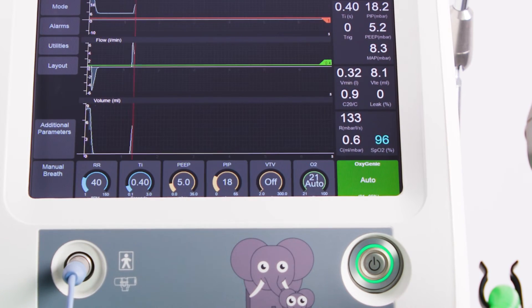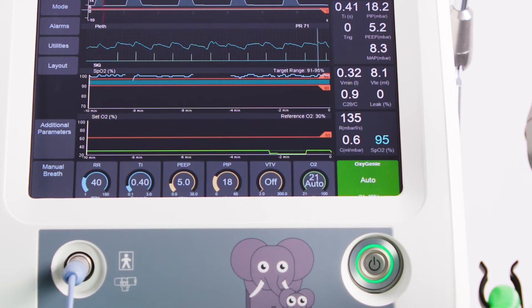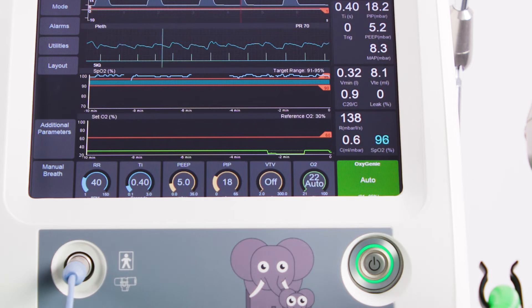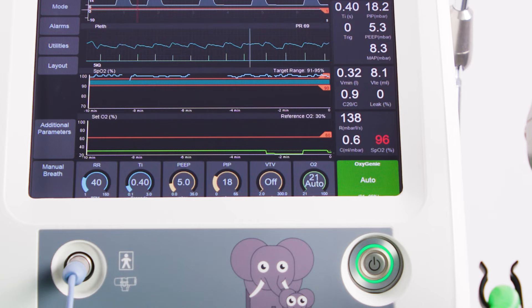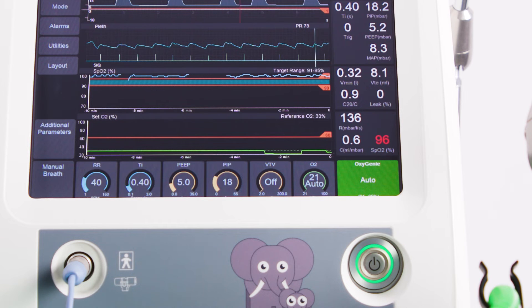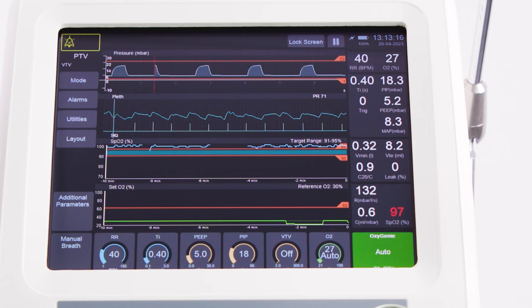Oxygeni displays 'auto' plus the current delivered O2 value, which is updated every second. Please note, you may see a delay between the real-time set O2 value and the monitored values as the reading stabilises.